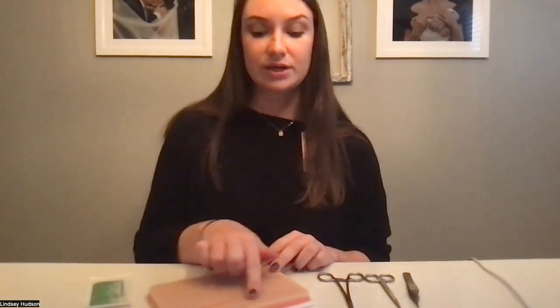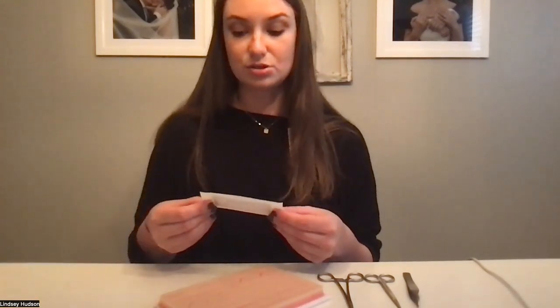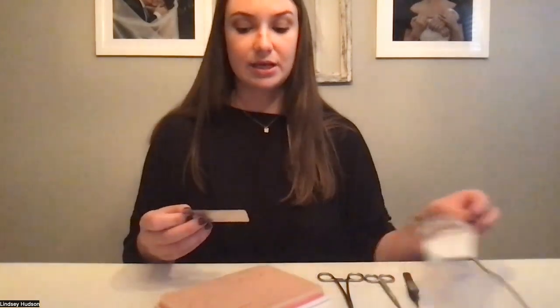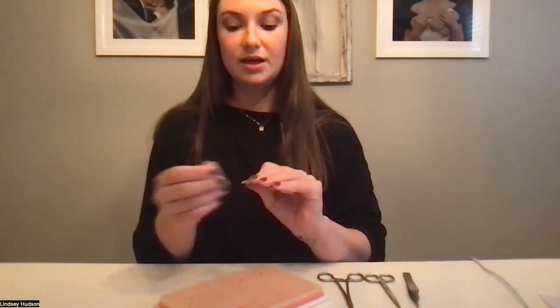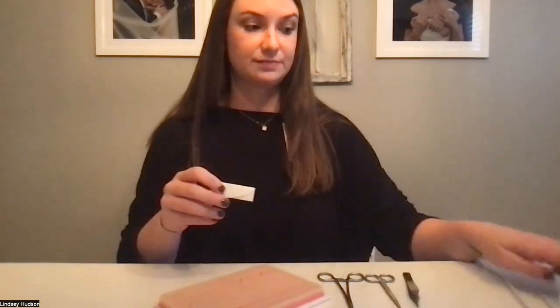The patient does not have a betadine allergy, so we're going to cleanse that area inside of the wound and all the way outside on the skin to kill any bacteria or anything that's on the skin that could cause an infection. So this whole area has been cleansed with betadine, and we are now going to get started with the sutures. So like I said, this is on the back. So we're using a nylon 3-0 non-absorbent suture, and we're going to do our sutures in an interrupted fashion.